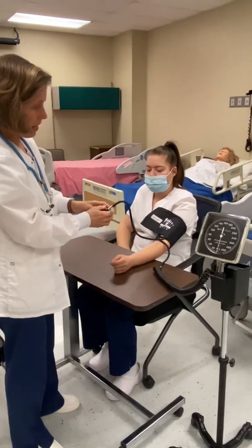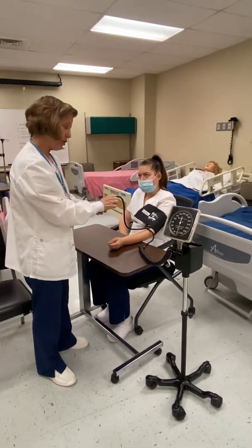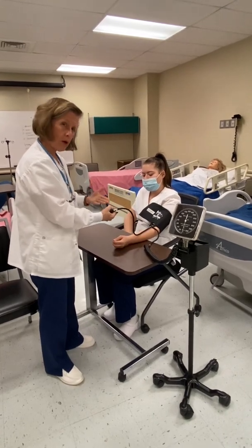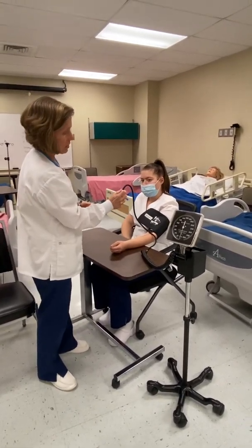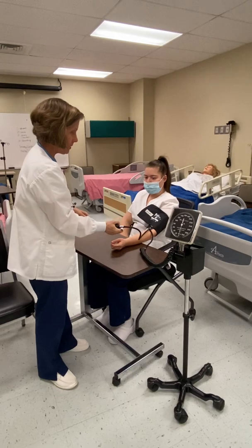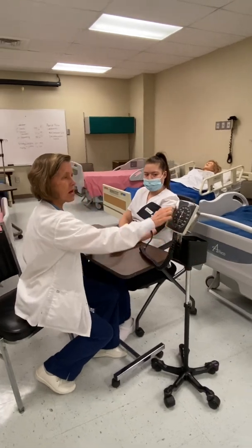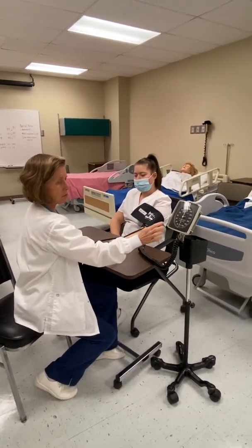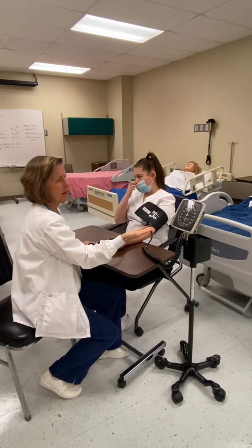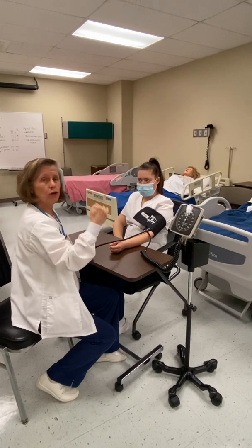Make sure you have your valve closed properly — righty-tighty, lefty-loosey. I encourage you to hold the bulb in your dominant hand so you can control the screw valve by closing it away from you. The manometer reads in increments of two millimeters of mercury, so you will never get an odd number like 63 or 109 — it will always be something like 82, 84, or 86.